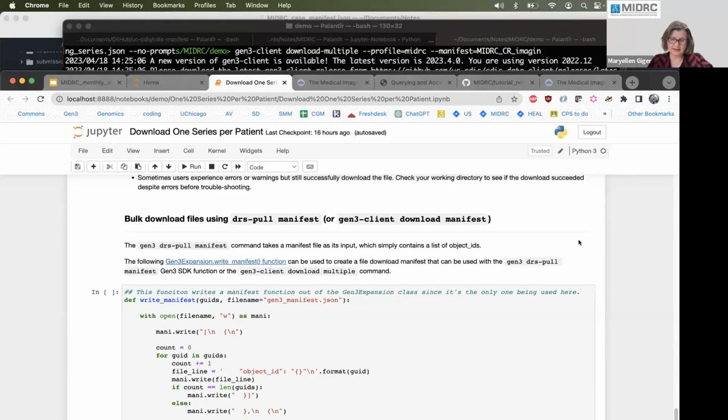Other questions. I really enjoyed seeing the query builder, which I know you just mentioned again, but it really gives the MIDRC user multiple options to learn to use MIDRC, using the tabs on the left in the Explorer. If you want to get more sophisticated, use the query builder.